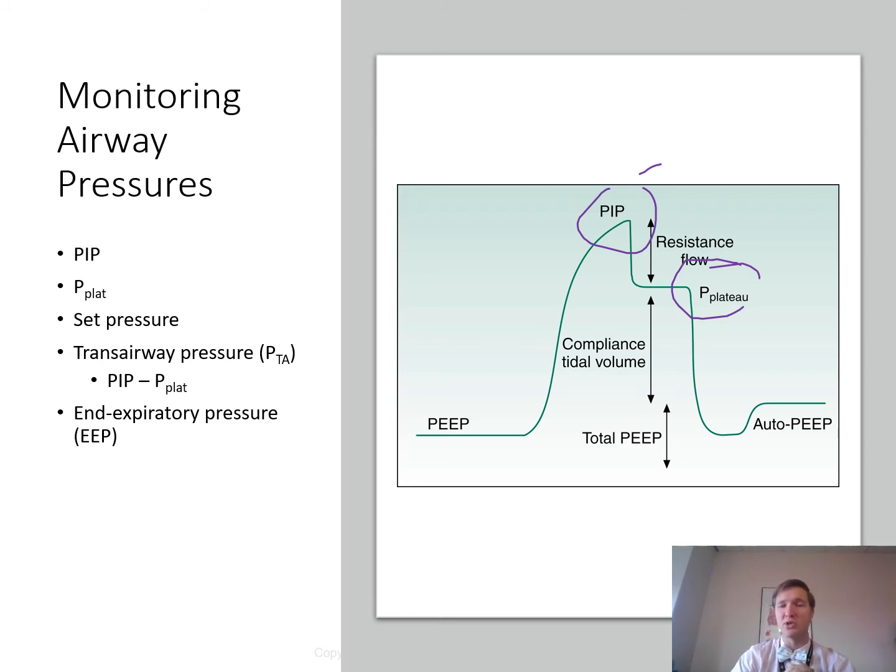So most of the times you don't directly control mean airway pressure unless it's a high frequency oscillating ventilator, but it's indirectly affected by all the settings that we talked about there, your duty cycle, as well as your PEEP, so on and so forth, your frequency and stuff. So the depth of the breath. One of the things that here we have to look at with end expiratory pressure, it is the lowest pressure measured during the expiratory phase of a breath. So end expiratory pressure should usually be above atmospheric pressure, and if it is, it's called PEEP or CPAP.